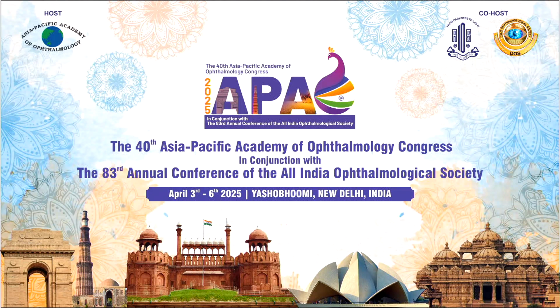I think this is a nice case also for femto, actually. I'm not a fan of femto, but with this mature cataract, doing rexus is tough, and if you have a femto available, I think this is an ideal case for femto.